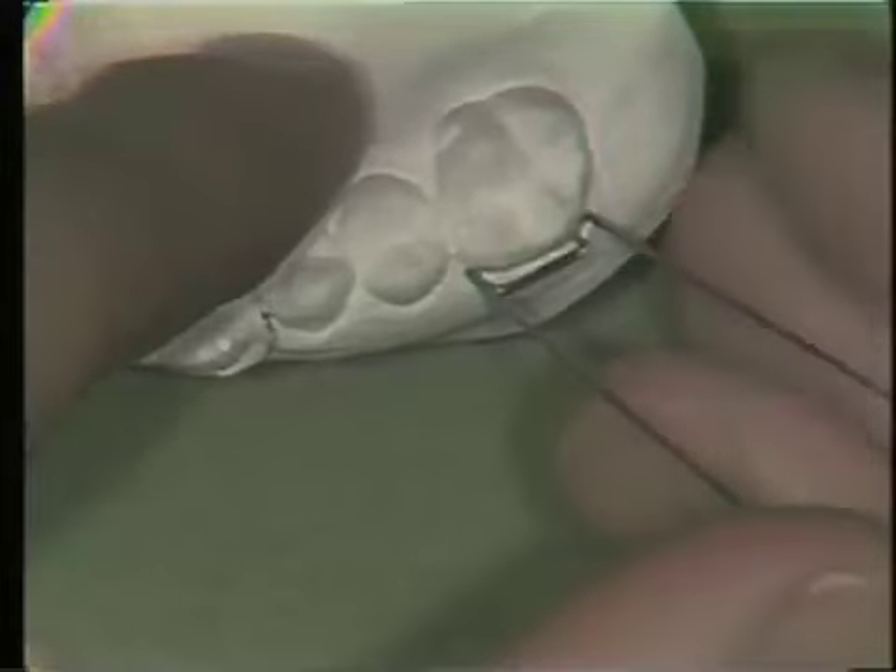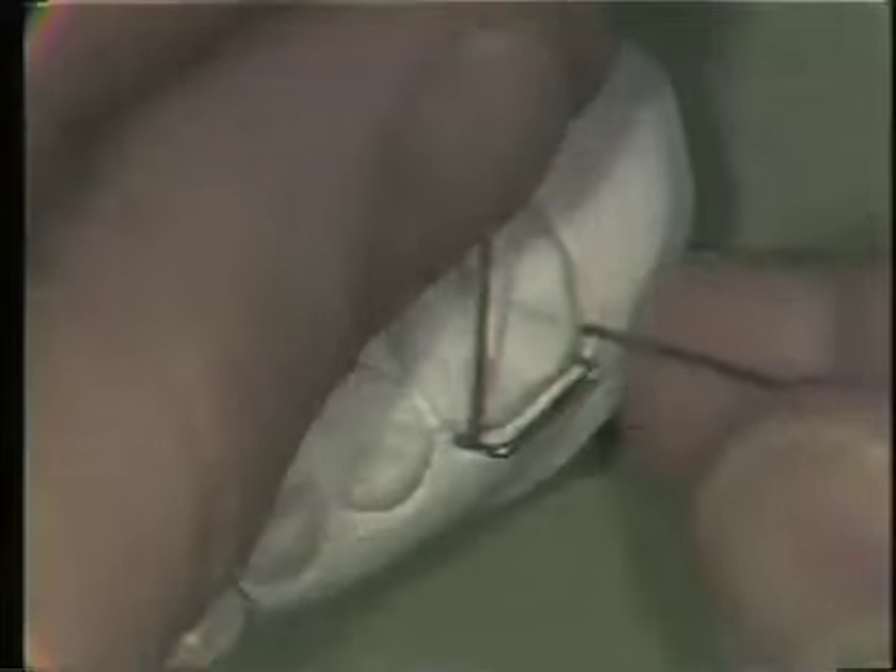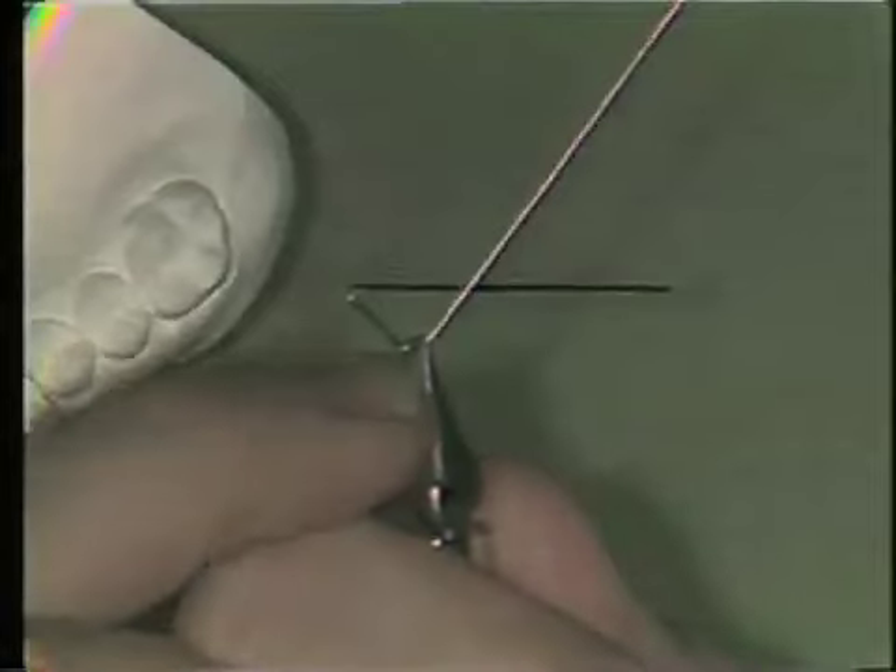After this segment of the Adams clasp is bent the way you'd like, the next step is to place the plier into the loop portion again and begin to sweep the wire towards the occlusal crossing. This is done with a series of small bends, always placing the wire back in the pliers in the same spot, and keep bending until the wire is adapted through the marginal ridges of those two adjacent teeth.